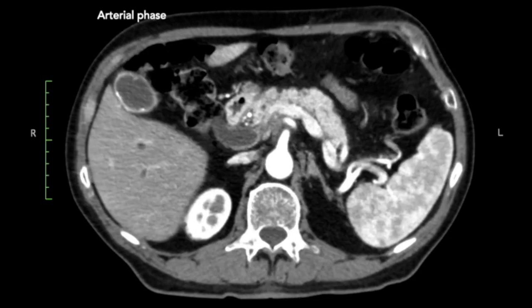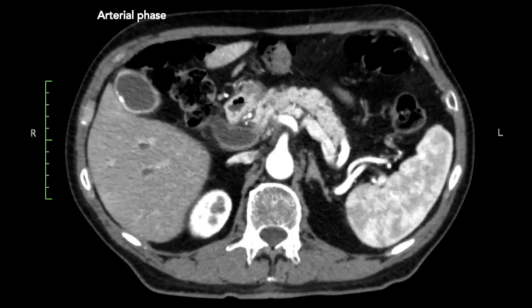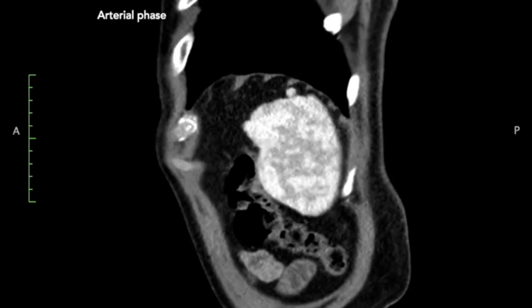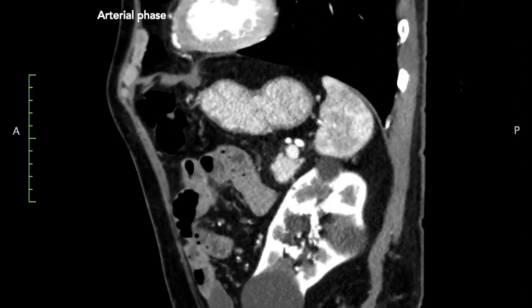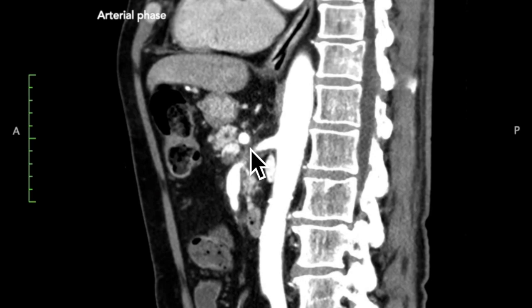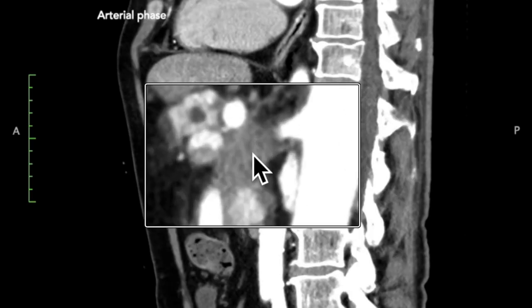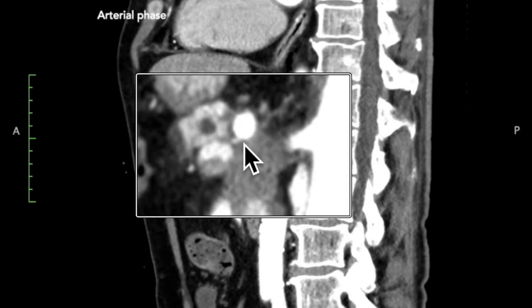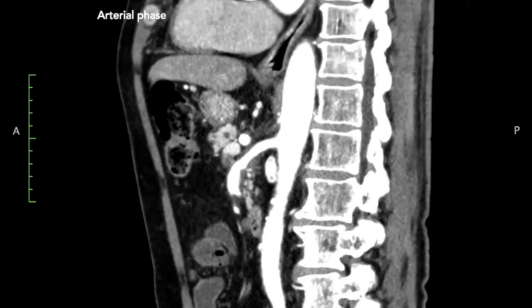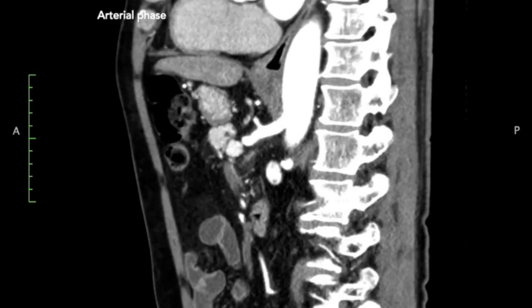Then, easily overlooked, is involvement of the hepatic artery, with tumor growing in a cephalad direction. This is best assessed in the sagittal plane. Here in the sagittal reformat, the celiac trunk gives off the hepatic artery, which runs behind the pancreatic body. The tumor here has contact with the common hepatic artery at 0 to 90 degrees. Looking at the celiac trunk itself, it is free of tumor. So regarding arterial involvement, we have 90 to 180 degrees of the SMA and 0 to 90 degrees involvement of the common hepatic artery.